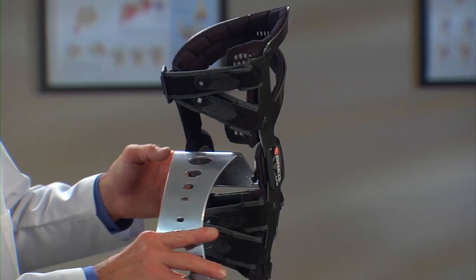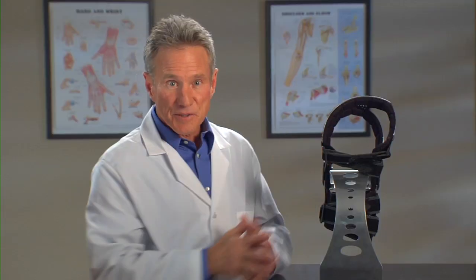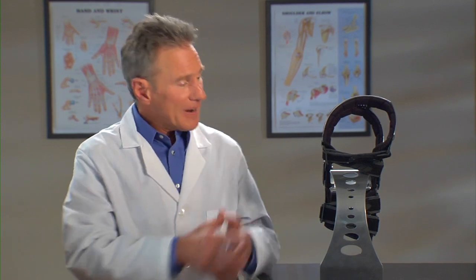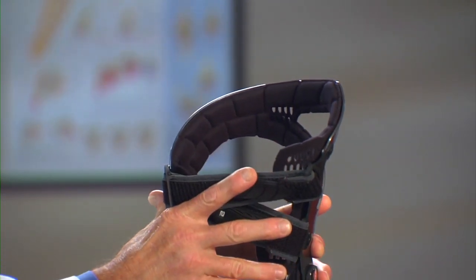Third, LPR has these grooves and ventilation windows cut into the padding. They're designed to move moisture and heat away from your skin, helping you stay cool and comfortable. This padding also grips your leg to help prevent the brace from moving around on your knee.